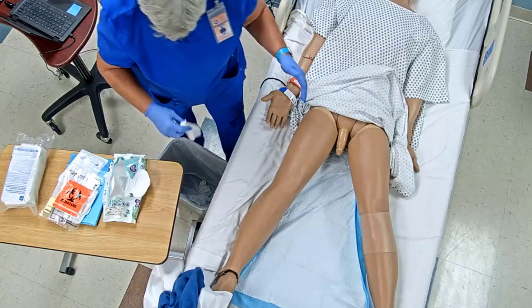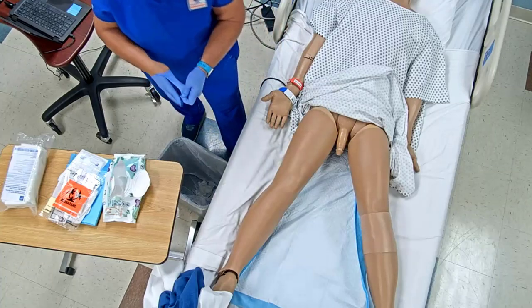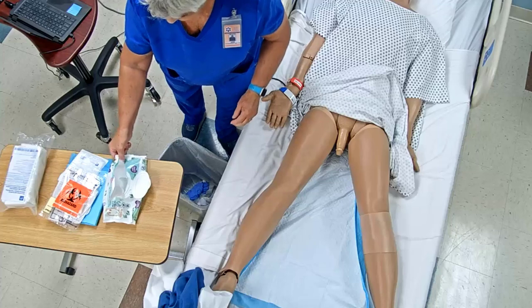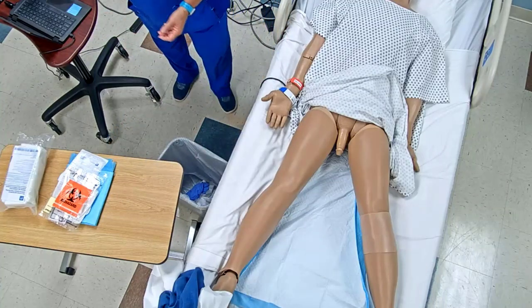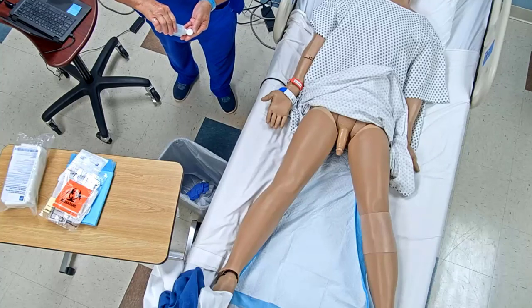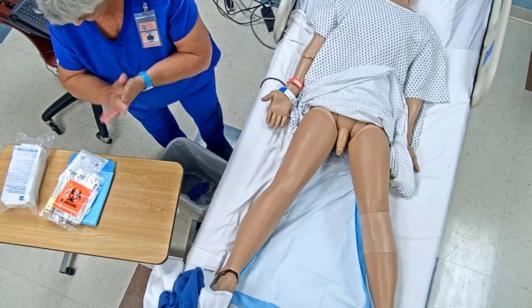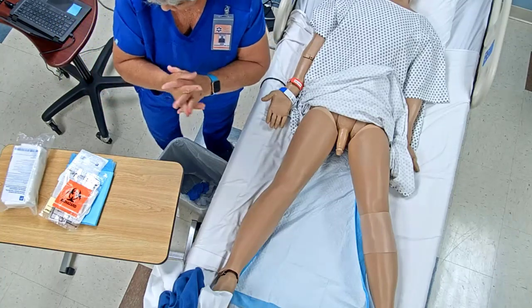Okay, so once we've done the pericare, we're going to go ahead and take these gloves off, glove to glove, skin to skin. I'm going to put these back over here since I took my gloves off. You always want to wash your hands. And we're going to set up our field.